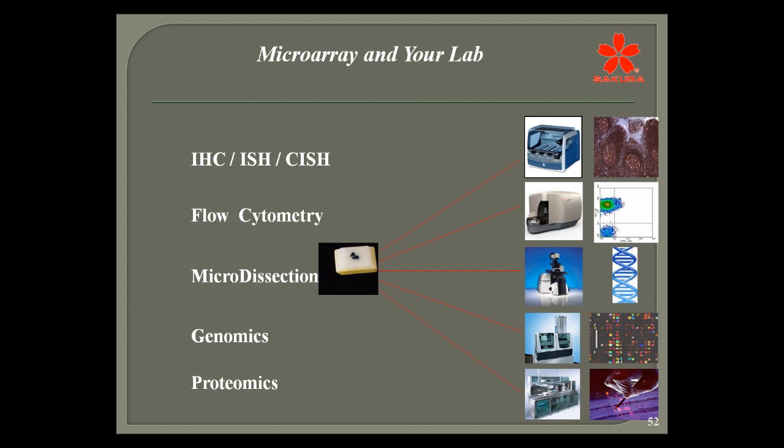So as we look to expand into where we're going with our lab assays, with lab testing today, with histotechnology, there are lots of things that we're doing with just one tissue block that years ago was more or less unheard of.